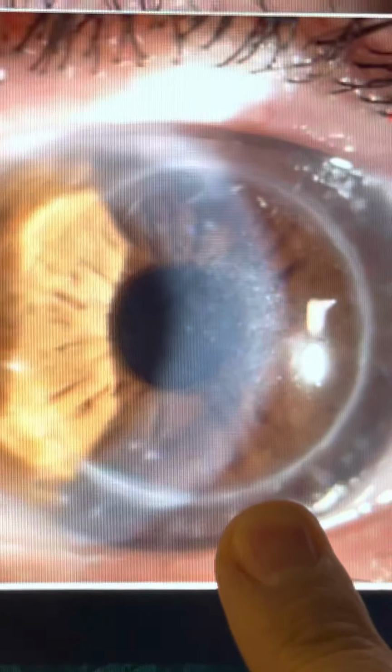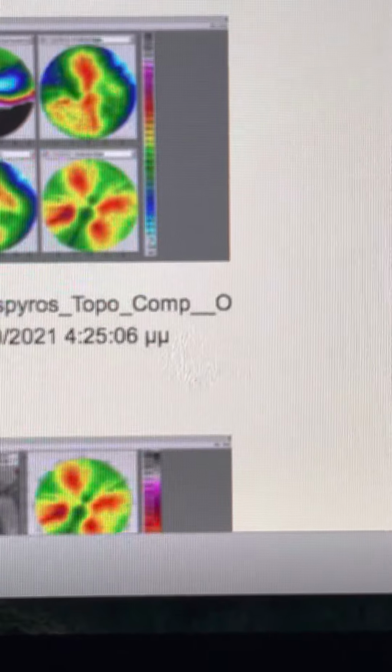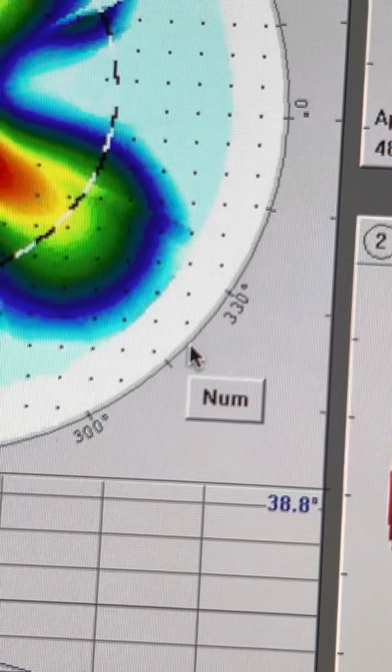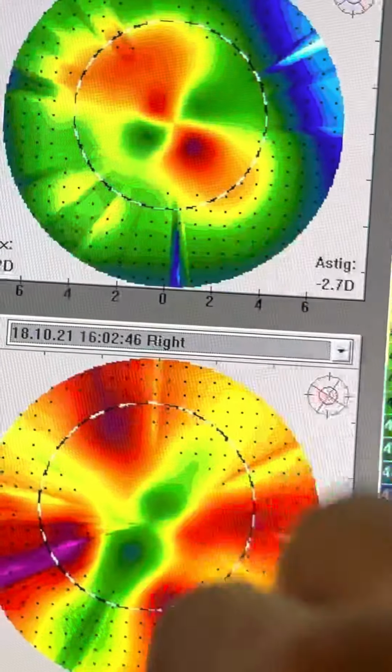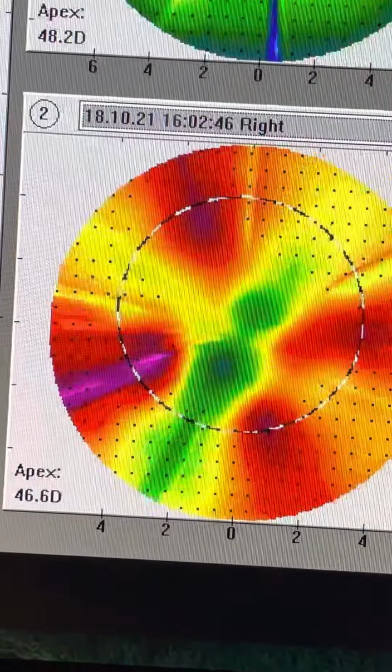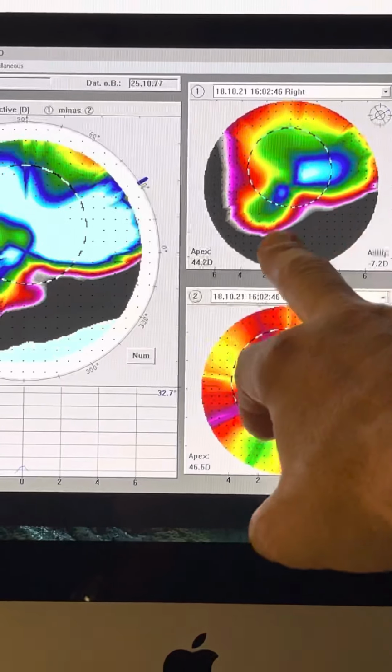We're gonna go and look, which I find always very impressive and dramatic. A lot of pictures here. We'll try and see. Yesterday, we removed some sutures from the 10 o'clock position seen here and the 5 o'clock position. And this is what we got as post-op topography. And if I go and look at the total pre-op to post-op change, we will have this as a summary of where we started with this patient. And remember the remarkable amount of ectasia here and astigmatism.